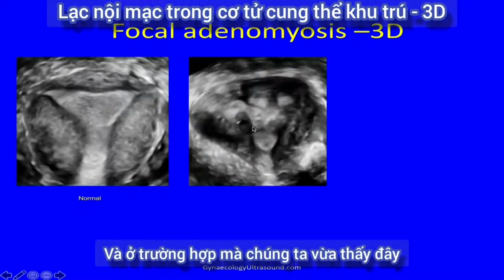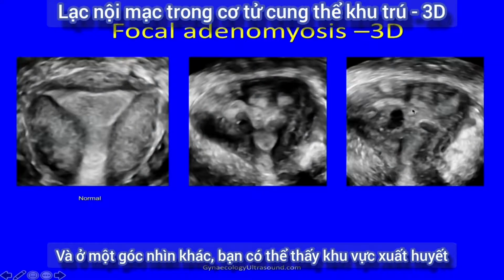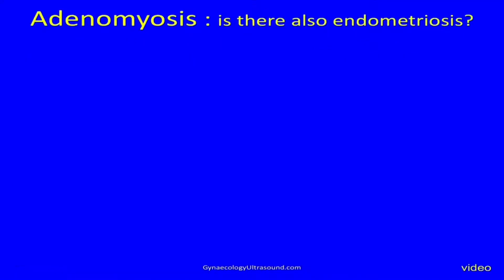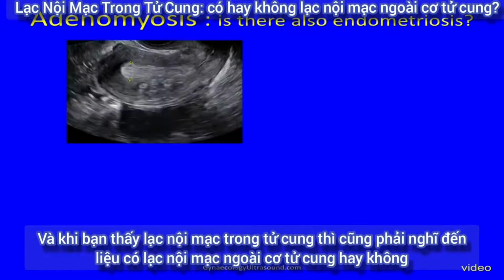And then here, on this case we've just seen, this is the outbudding of endometrium into the myometrium, and in a slightly different plane you can see these areas of hemorrhage. So this is focal adenomyosis. And when you see adenomyosis, you have to think, is there also endometriosis?